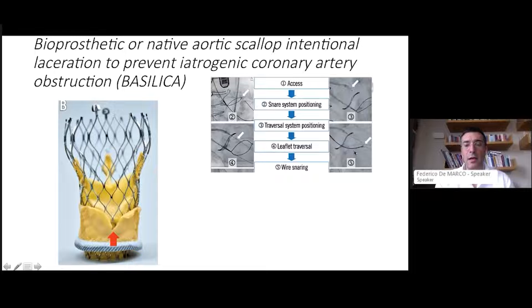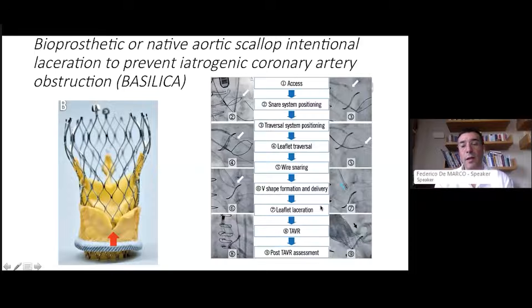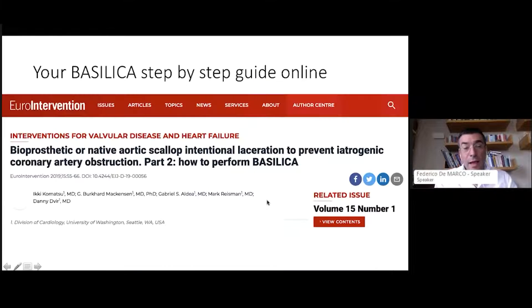You pierce the leaflet using an electrified 0.014 guide wire, which is then snared inside the LVOT. After forming a special V-shape on the 0.014 guide wire, you electrify the guide wire a second time, and by pulling on both systems simultaneously, you create the leaflet laceration. After this, you complete your valve-in-valve TAVI.